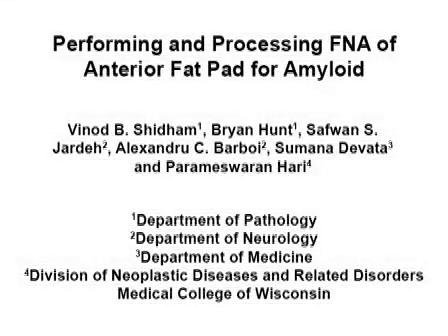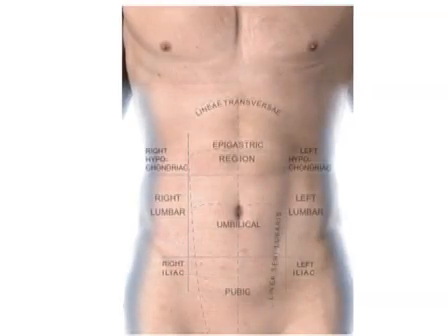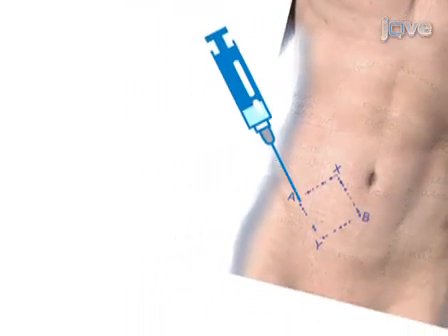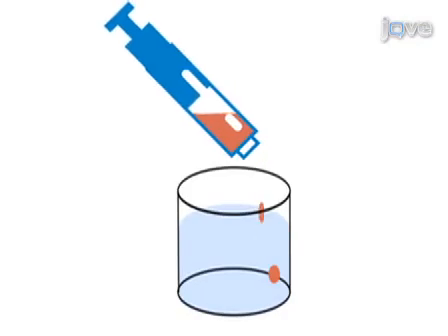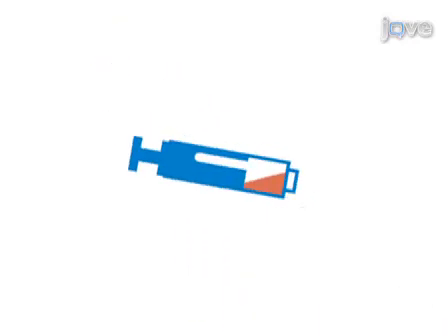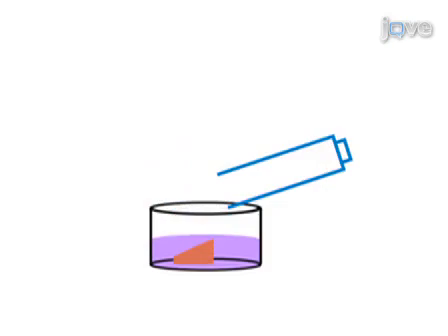This video demonstrates fine needle aspiration biopsy of the anterior fat pad and a procedure for processing the biopsy specimens for microscopy. Five to six fragments of fibroadipose tissue are transferred from the biopsy syringe into glutaraldehyde solution and the remaining material is allowed to clot in the syringe. 10% formalin is then aspirated into the syringe and the plunger is removed to transfer the clotted fibroadipose tissue into 10% formalin.